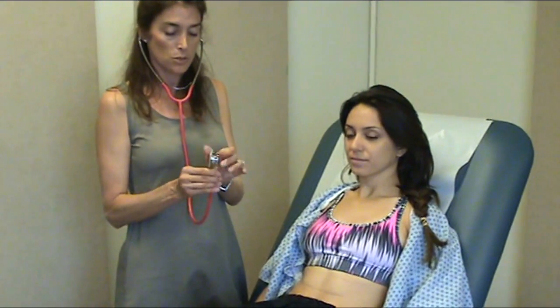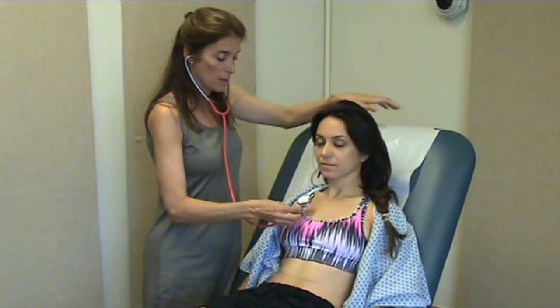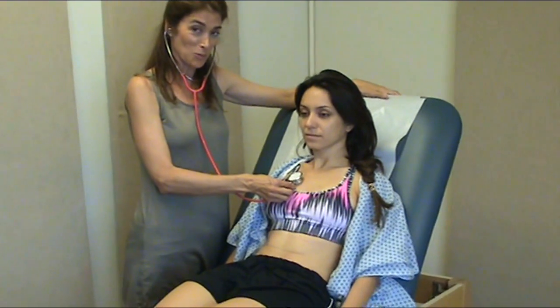Then you're going to switch it over to the bell, and you're going to listen for low pitch murmurs.